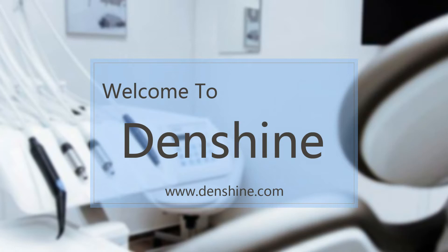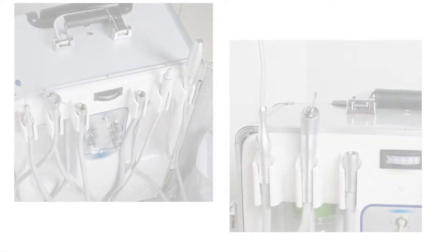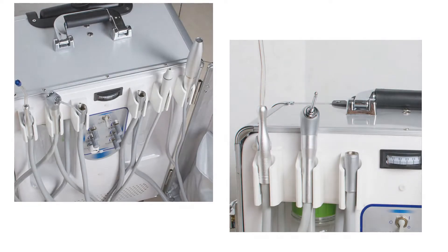Hello everybody! Welcome to Denshye's video. Today we'll bring you the Denshye portable dental unit and introduce all of its functions in sequence.